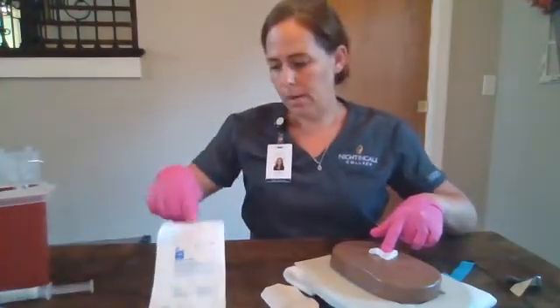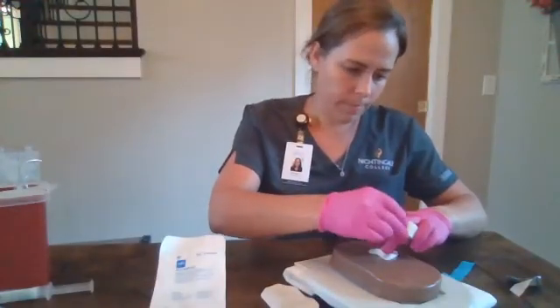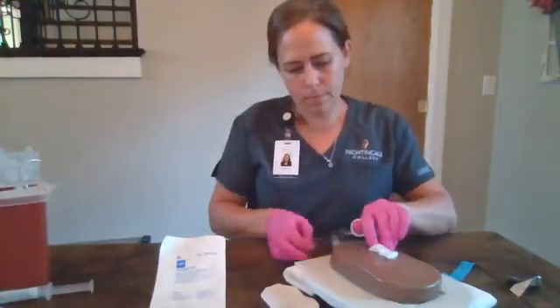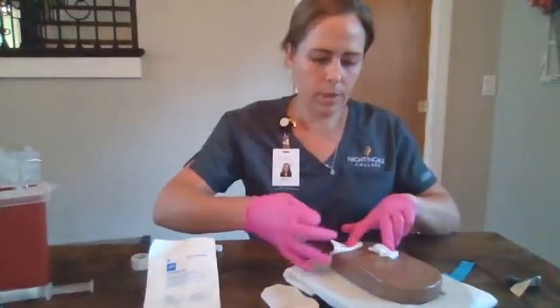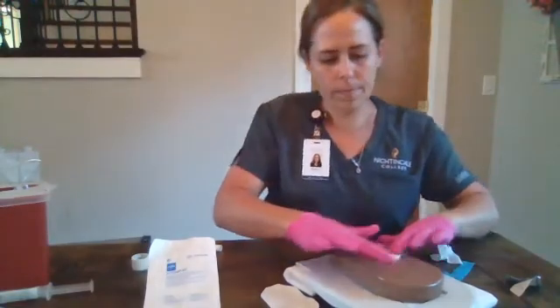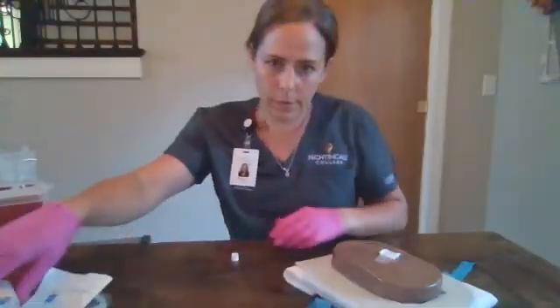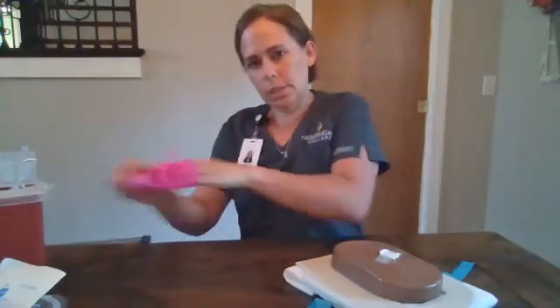When we are ready and bleeding has been controlled, we will place a new sterile gauze over our site and we will tape it. Discard all of our supplies in the trash. Any sharps will go in the sharps container. Take off our gloves, discard those, perform hand hygiene, and we will document our procedure.